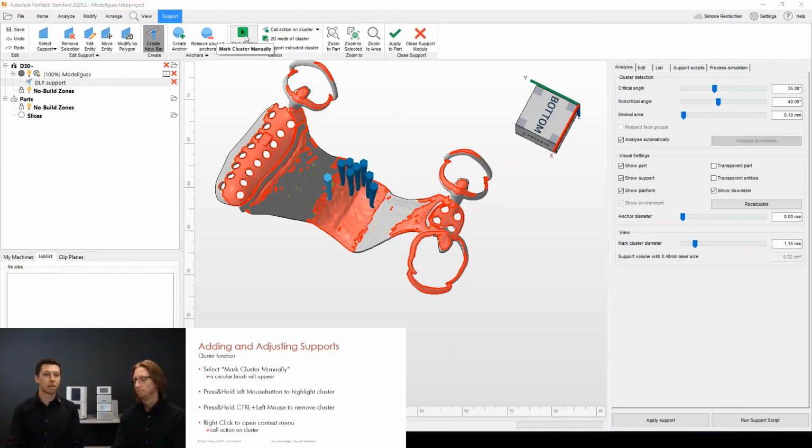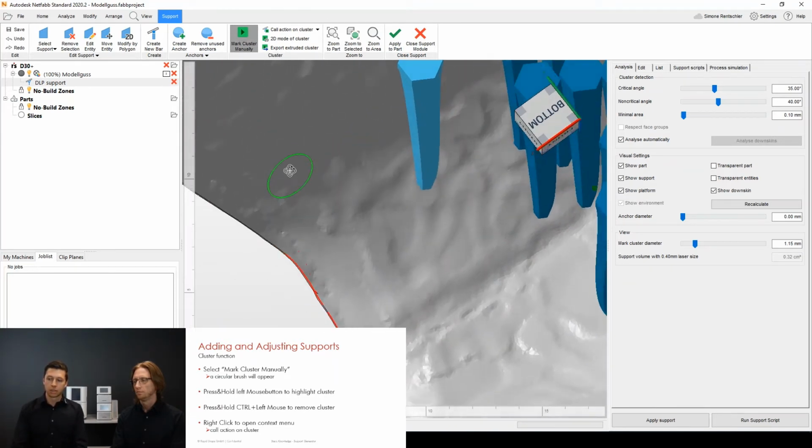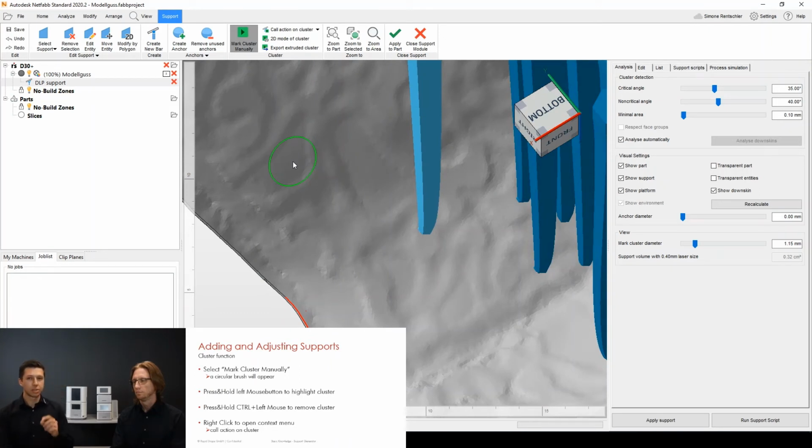So you select the mark cluster manually on top here in NetFab. And as you can see, the automatic analysis is just gone. So there's no automatic cluster detection anymore, because now I want to do it manually. As I mentioned, this is the circle brush which will appear, and you can change the size in the analysis tab. So on the right side you can see mark cluster diameter, and it will change it. Or you use the shortcut and you just push and hold Control and use the mouse wheel to change the size. So recommendation is don't make it too big, as I said, otherwise you might have some struggles with the calculation power of your PC.